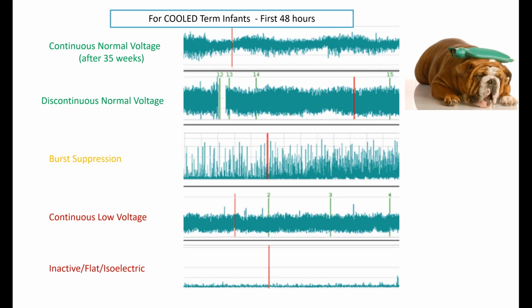That was my next question. When you're looking at these babies and they start seizing, how many of them are in non-convulsive seizures or non-convulsive status? The literature is showing about 80%. That's what I heard, and I just thought, wow, that's really significant. So once you get the aEEG on, you're able to notice that the baby is having seizures that you're not able to physically detect. Especially HIE babies.